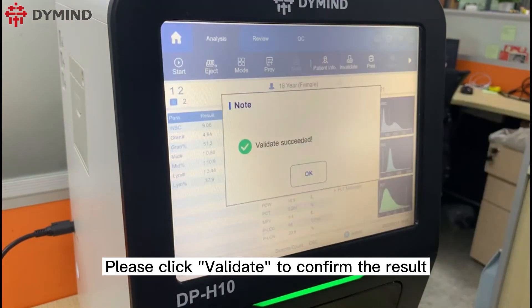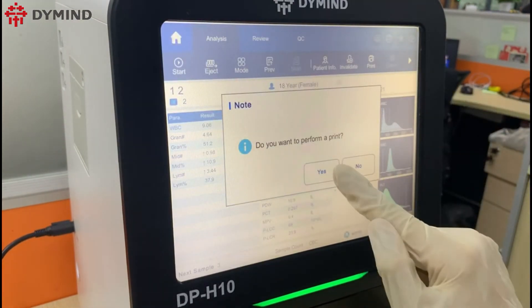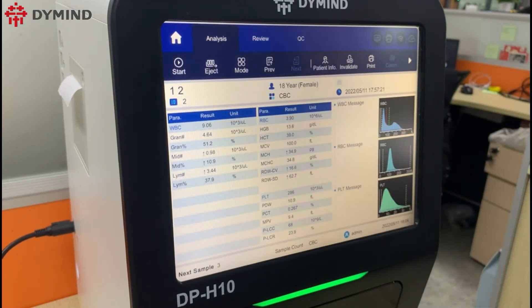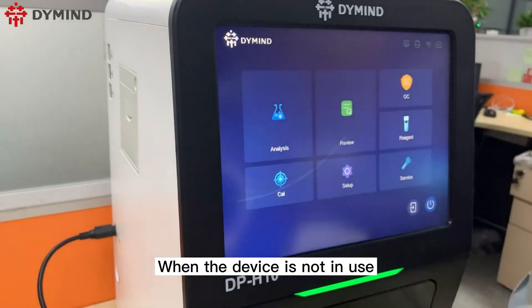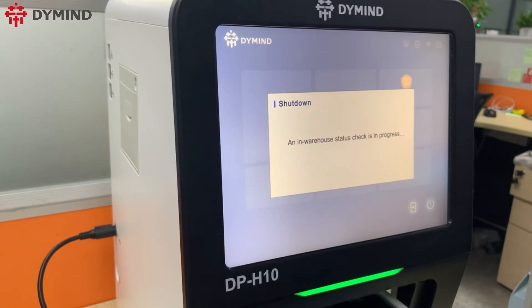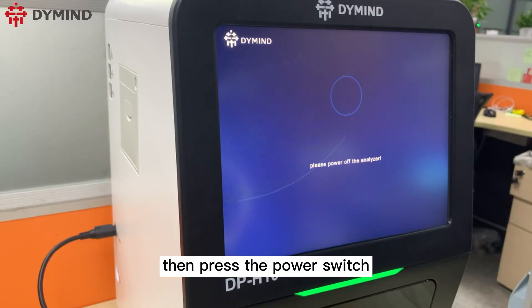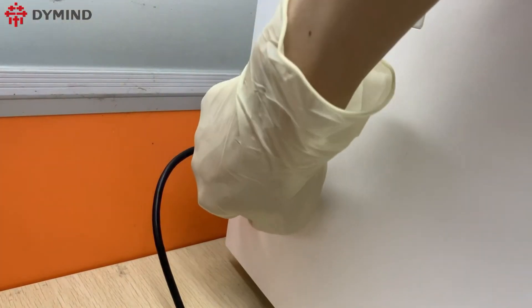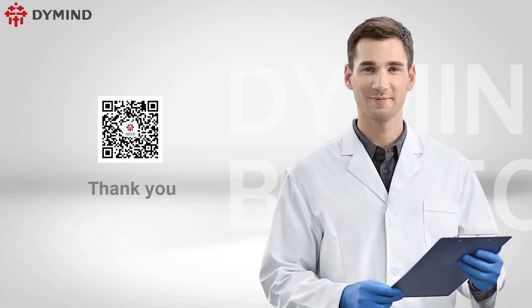Please click validate to confirm the result, then click print to print it out. When the device is not in use, please click the icon to power off, then press the power switch.